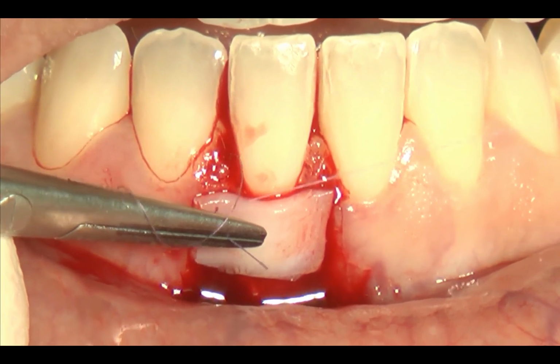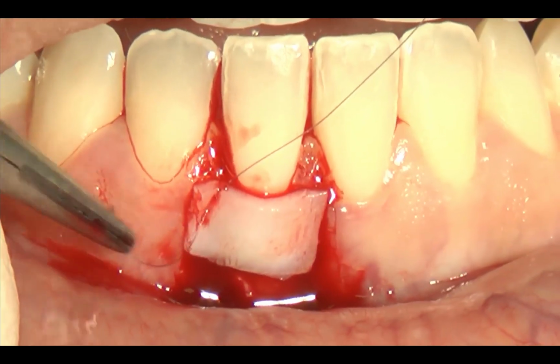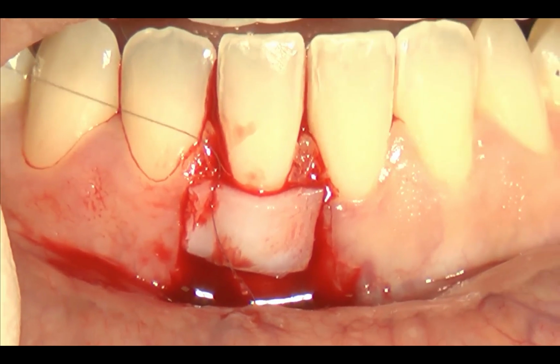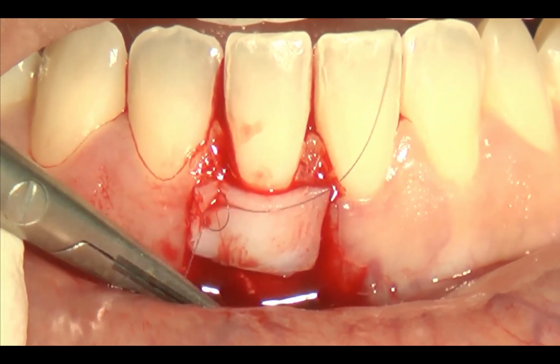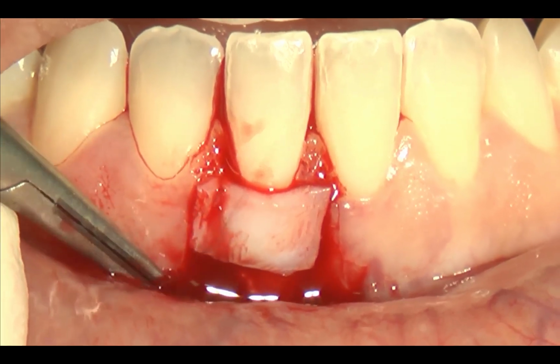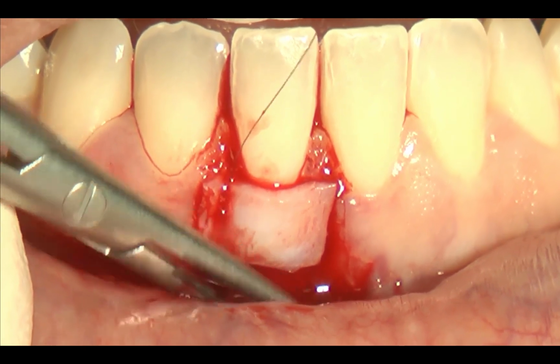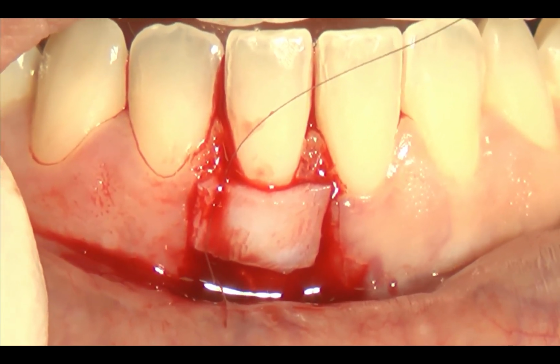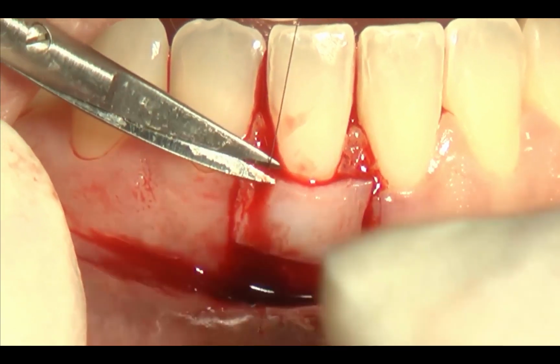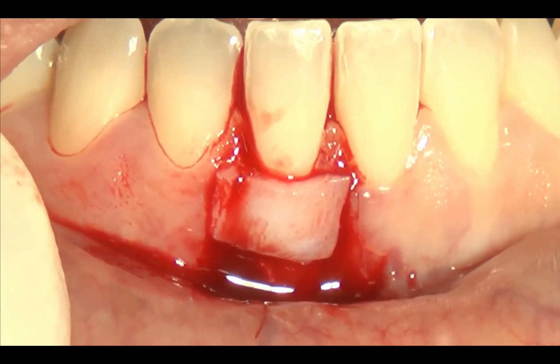Did it happen if you left some remnants of epithelium beneath the flap, on the graft, I mean? If it's only some remnants, nothing happened, because the first healing process of the graft is the desepithelialization. So they will be removed by themselves. If you leave the old epithelium, it's a problem.